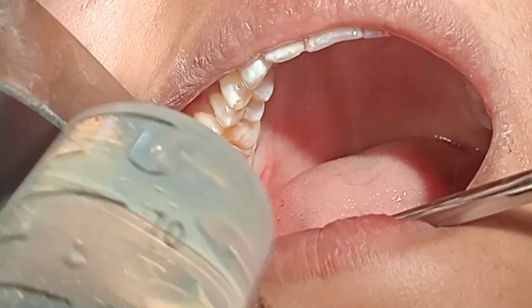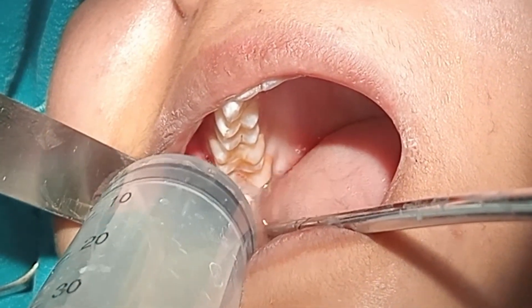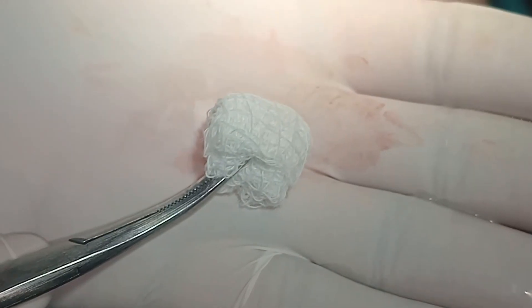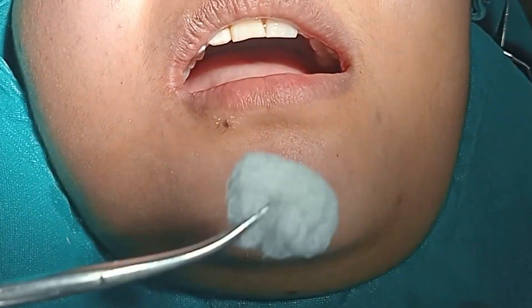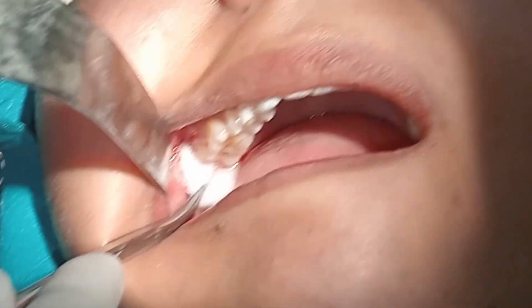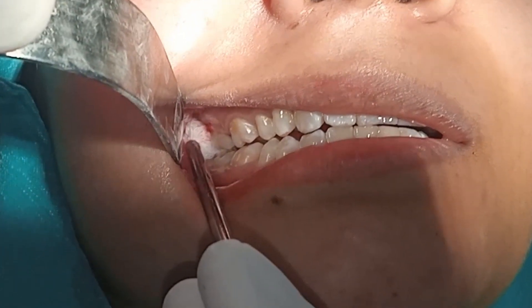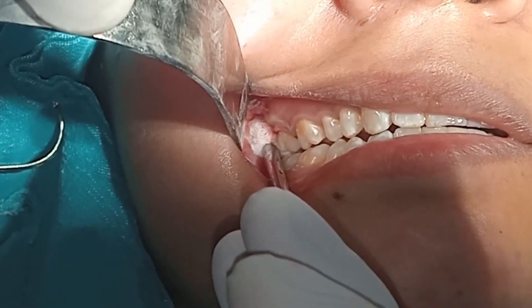I am going to irrigate the socket with normal saline, and the irrigation should be done with high pressure. This is the pressure pack that I have prepared for the extraction socket. The gauze should be tightly condensed for a proper pressure packing. The pack should be placed directly over the extraction socket and should not interfere with the occlusion by coming between upper and lower teeth — only then will it be able to apply pressure over the socket.